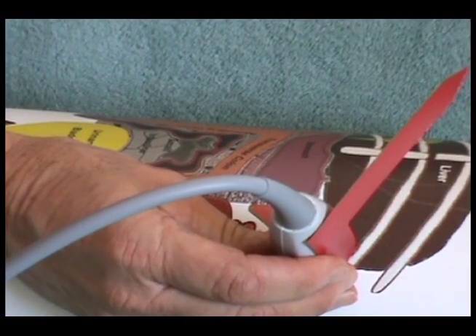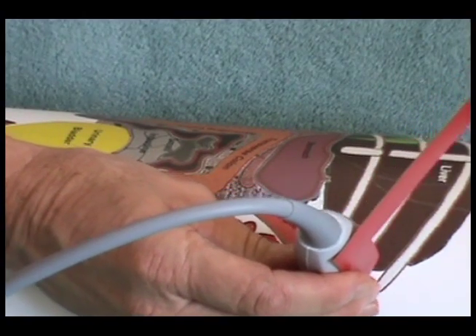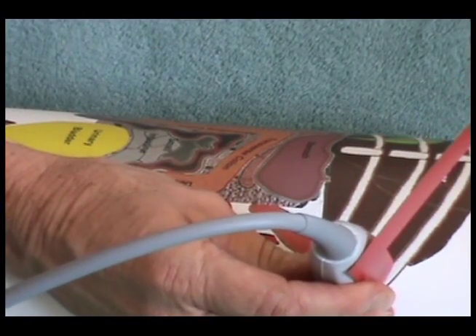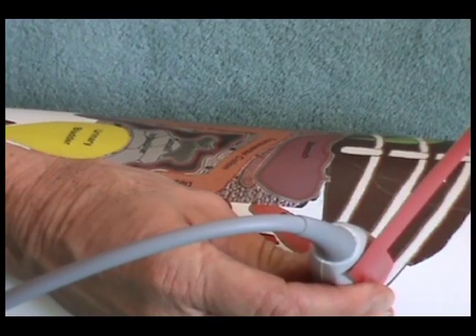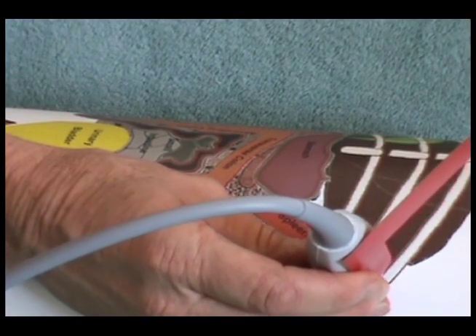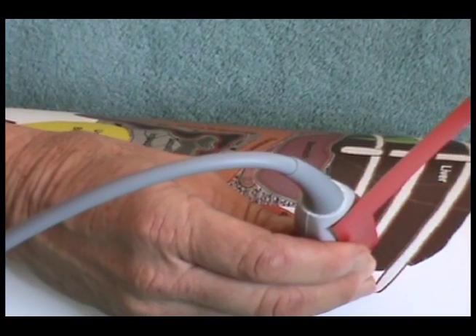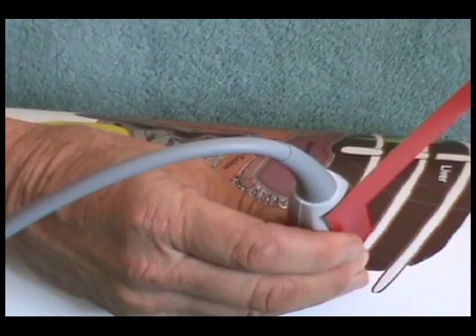Slide the transducer cranially till the spleen is no longer under the transducer. Then slide caudally and follow the spleen wherever it goes in the abdomen. Keep the transducer perpendicular to the patient's body as you follow the spleen.